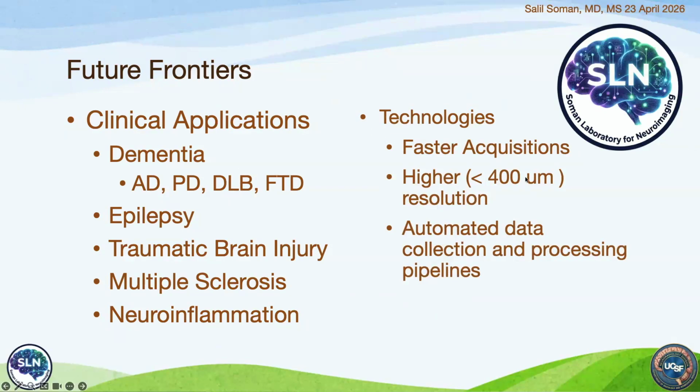But then also there are times where getting to smaller resolution would be super useful. Right now we can still do 0.8 millimeter isotropic in about 6 minutes or something, but that's getting kind of long and expensive for scan time. There are newer techniques, and some of my collaborators here have things that at least right now can get it down to 2 minutes, going to 0.75 isotropic, right? And once you do that, then all sorts of stuff's open.